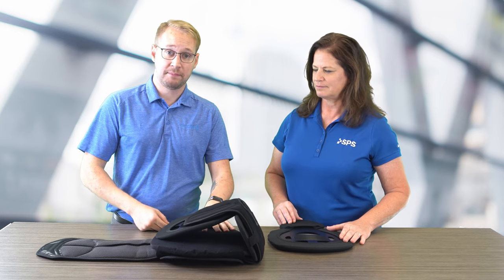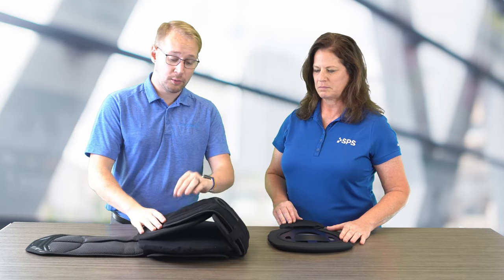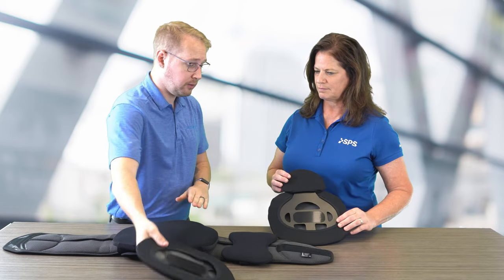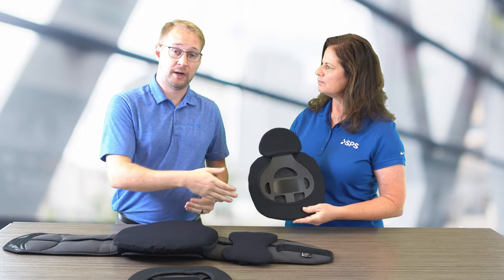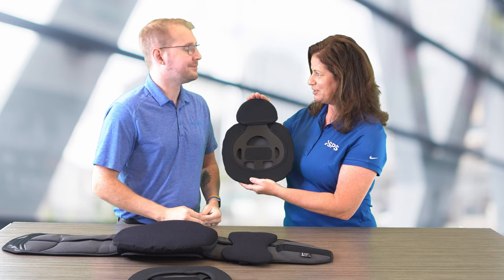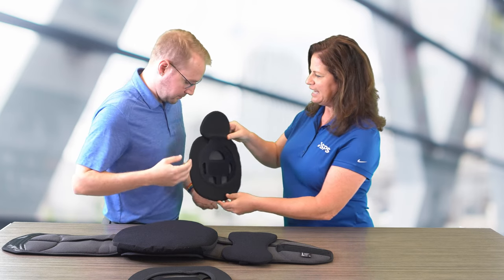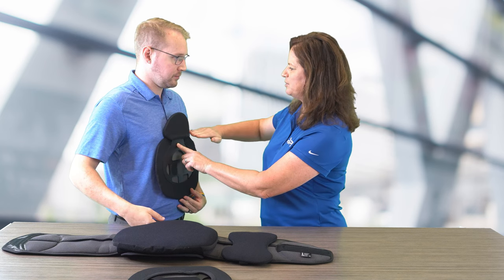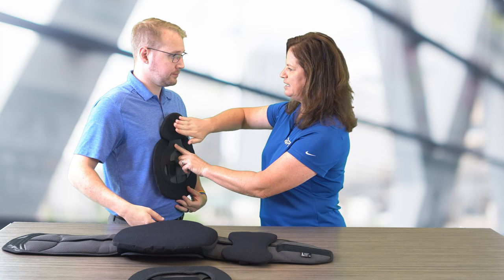Here we have the standard Sleek Adapt with the anterior panel on it. In order to provide even more stability, we can actually swap out this anterior panel and add in a more superior panel that provides more support. Just to confirm, this is the superior section and this is the inferior section, and it's going to be placed right at the xiphoid line and in conjunction with the nipple line, so that this can also stabilize and press against the sternum.